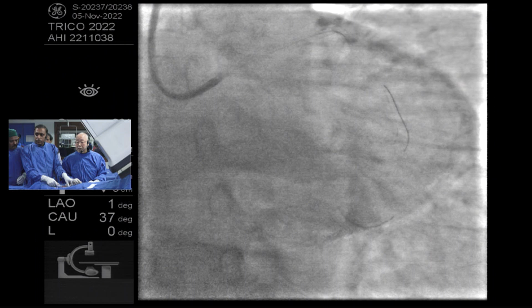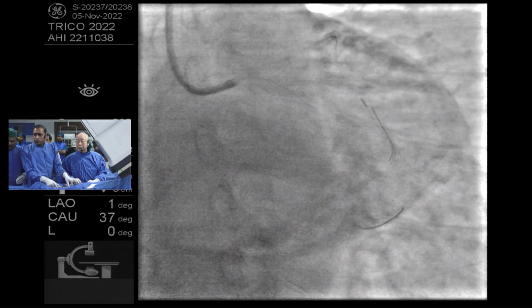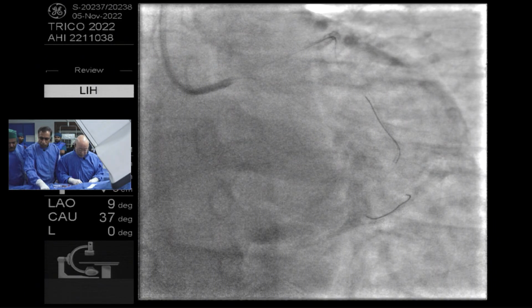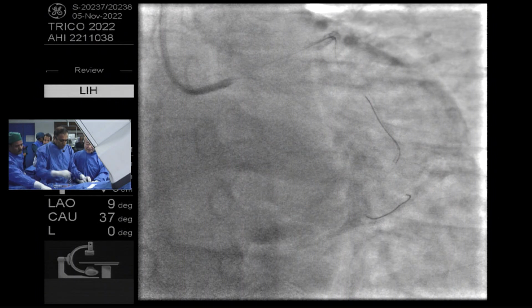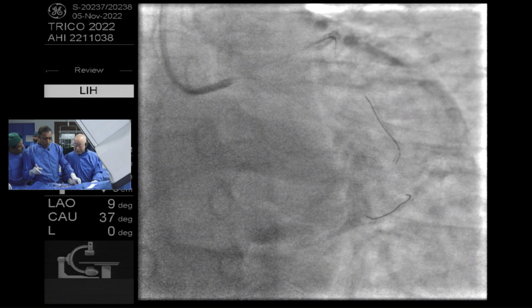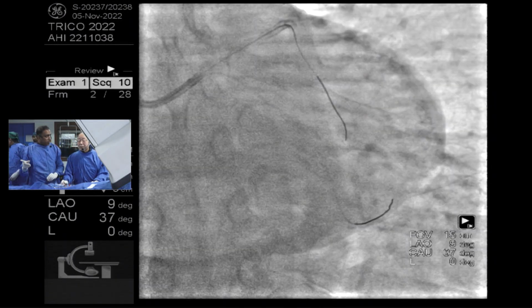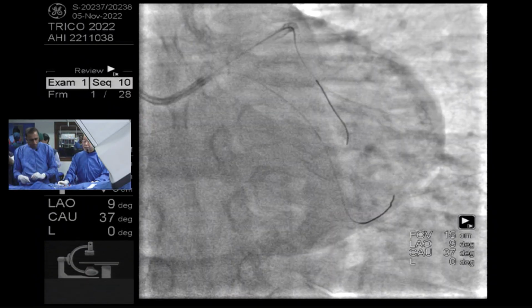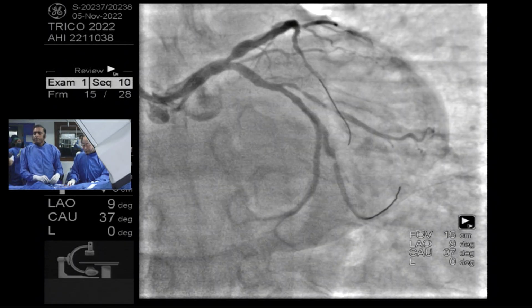Dr. Saito, would you like to assess the ostial LAD with FFR? Pardon? Functional assessment of the ostial LAD by FFR? Okay. Yeah, I think after treatment of the mid portion, the proximal LAD is a very discrete region, so resting indices may miss identifying the degree of stenosis in this case. So as you said, FFR should be better to identify it, if you want, yes.